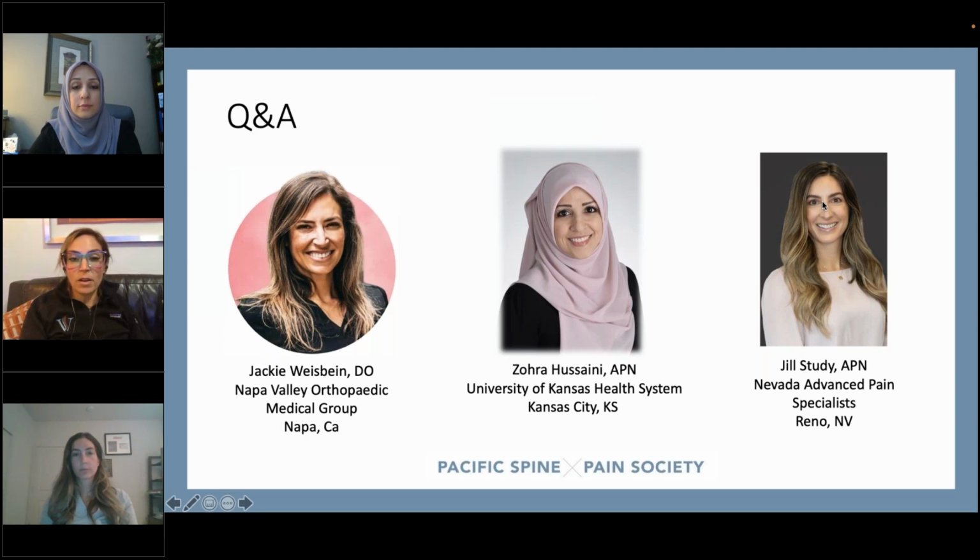So I was part of a study. There were two kind of landmark studies regarding low dose intrathecal opiates. One was Jay Grider and the other one was Magid Hamza, and I was on the Hamza study. And so both of these, we completely weaned our patients off prior to implant. So patients that were on oral opiates were weaned off their medication. Now, with Grider, they were weaned prior to trial. With Hamza, they were weaned to 50% prior to trial and then were implanted.